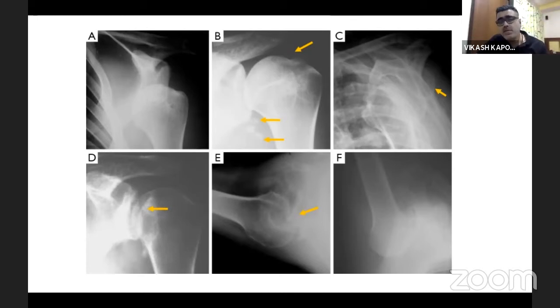These are the standard things which you expect to see in the X-rays: the anterior dislocation of the shoulder, anterior inferior. In cases where you have reduced it, and there is accessory damage to the teres minor or infraspinatus muscles in a severe dislocation, post-reduction you will sometimes see loose bodies or extra calcifications. The Hill-Sachs lesion, the engaged Hill-Sachs, and the luxatio erecta, if you get a photograph like that.